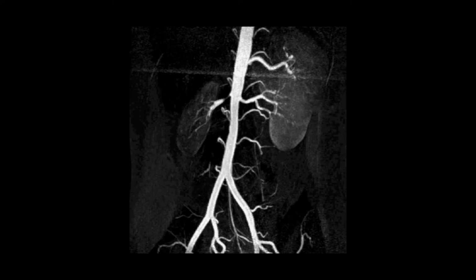So this is an unusual pathology you might not see very often. This is fibromuscular dysplasia, but it's a fibrointimal variant, which is a kind of subset of FMD. There are about 4 different types of FMD, and this is a subset called fibrointimal dysplasia, which is actually apparently very tricky to angioplasty, very fibrous.